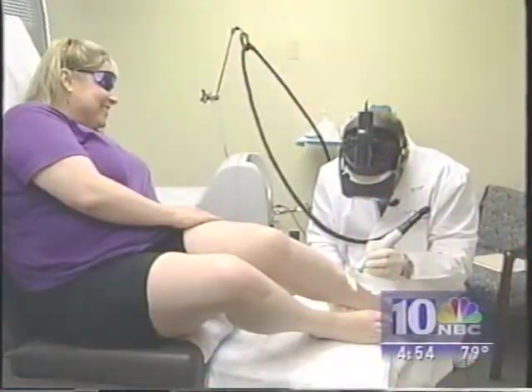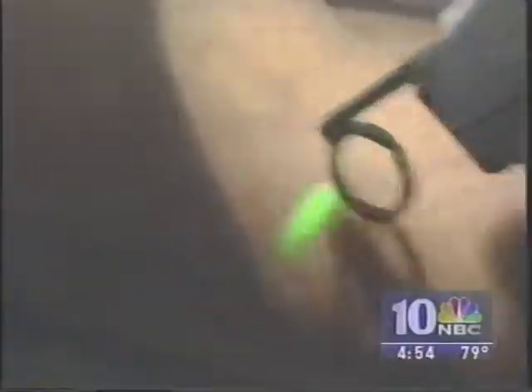So even if they disappear on the legs before our eyes, sometimes you have to treat them a second time. Afterwards, legs can look scratched or irritated for about seven to ten days. Denise went back six weeks later for the finishing touch. It was quick, fairly painless — it feels like a rubber band hitting your skin. And most of the veins are gone on the other ankle. It's amazing. The laser works best for smaller spider veins and for matting, veins that in the past were treated with saline injections and form large bruise-like patches.